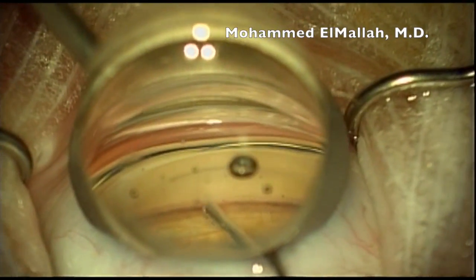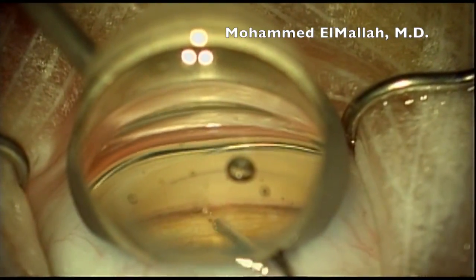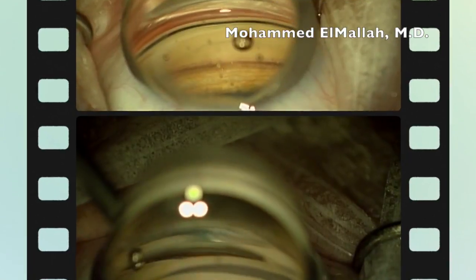If you're just starting implanting iStents, or contemplating implanting iStents, you've probably already heard that the most important thing is to have an adequate view. Take the time to get a good view, to adjust your zoom and your focus, so you're comfortable that you have a good view before attempting to implant the iStent.